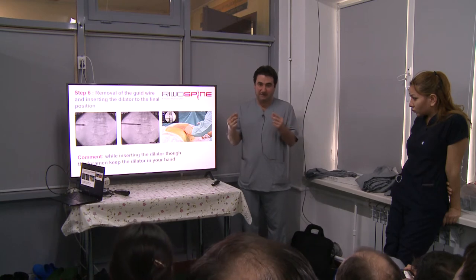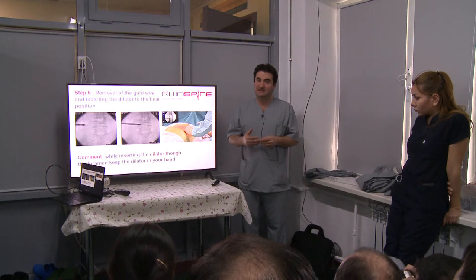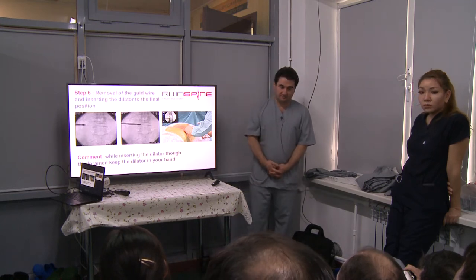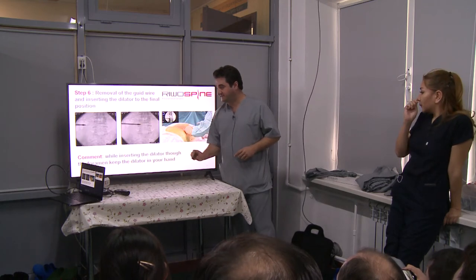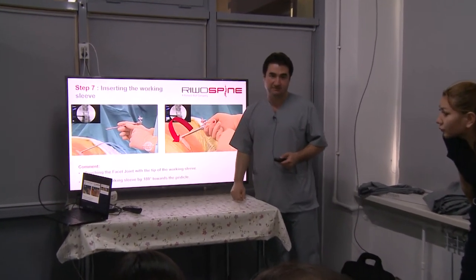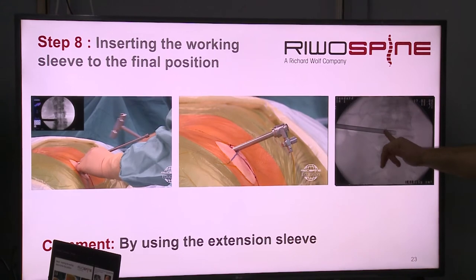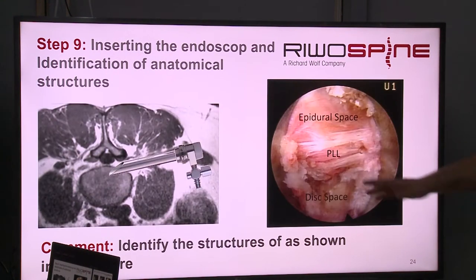If there is a collapse and the bilateral foraminal stenosis, then the decompression always does not work here. Yeah, you need to gain the space with the interbody cages or something like that. Yeah, and then we advance the sleeve dilator and fix it into the foramen. The next step, we insert the sleeve there, and then with the hammer we advance the sleeve, and in the final position here or here, usually we stop here. Then this is the final position of the sleeve.